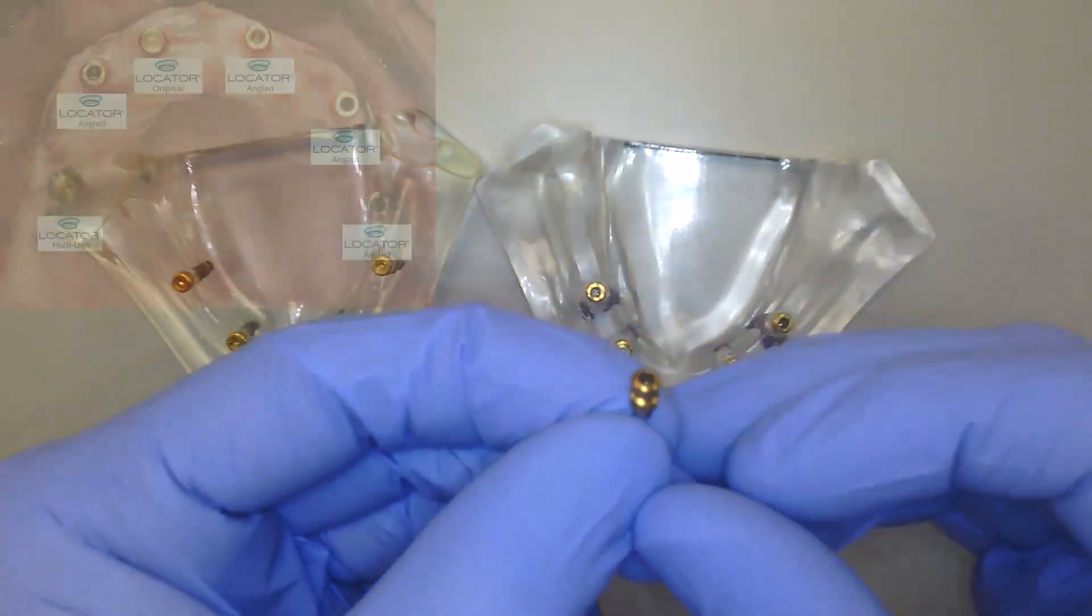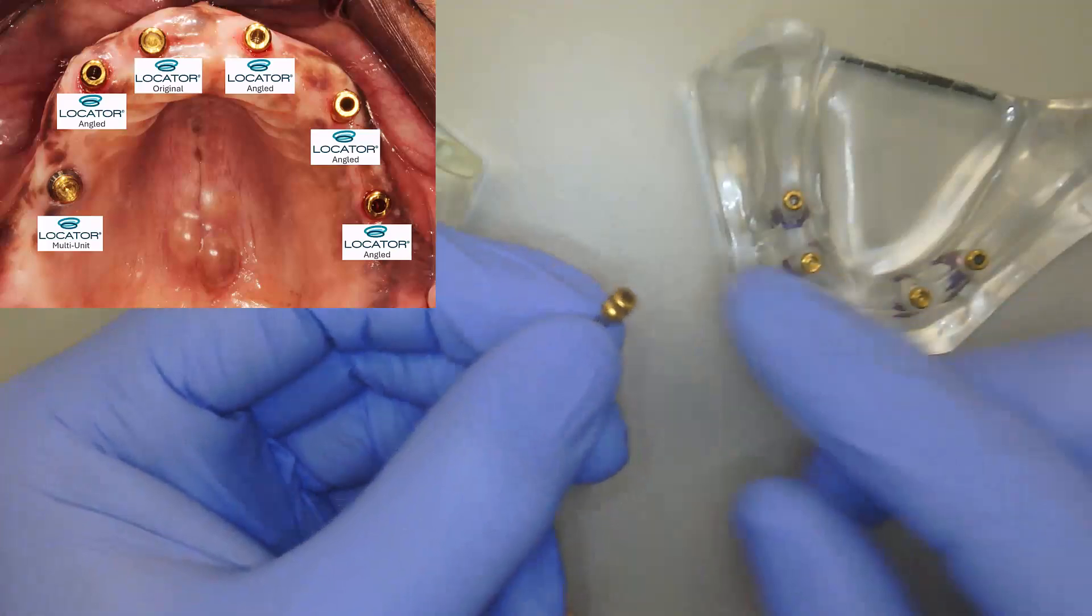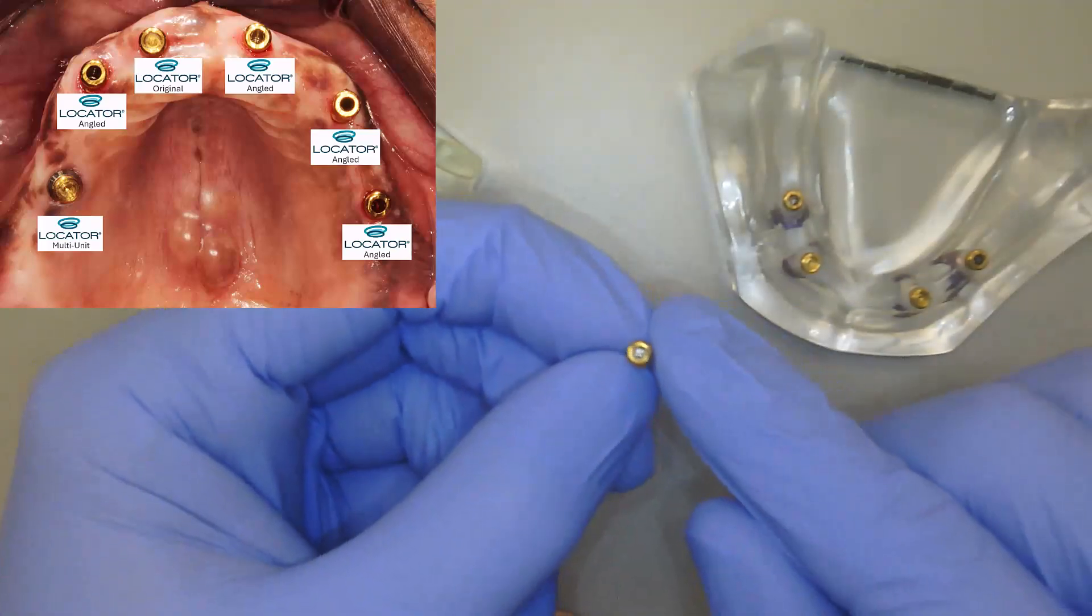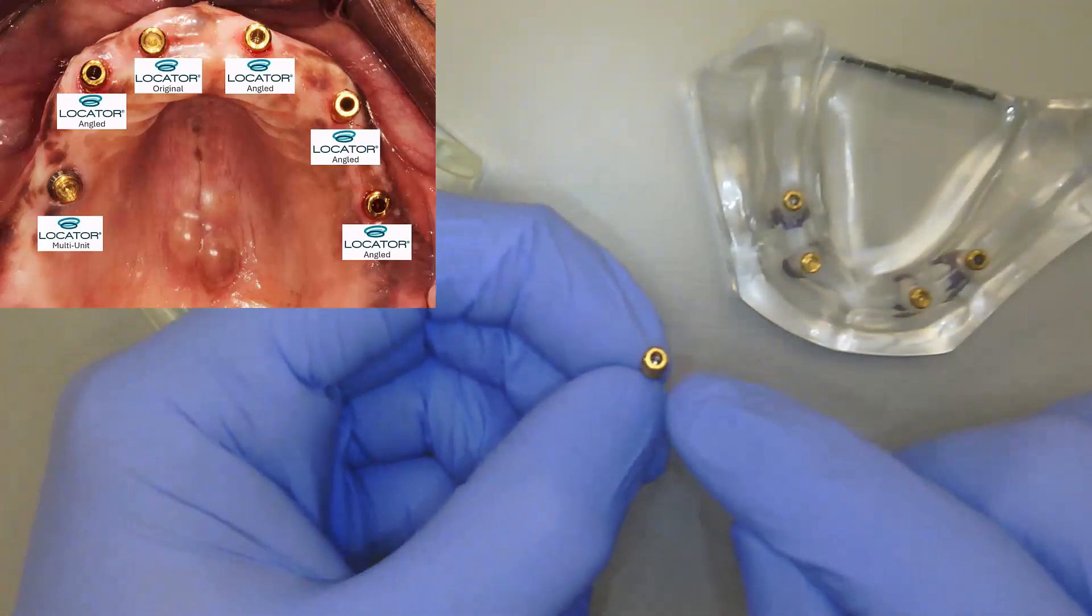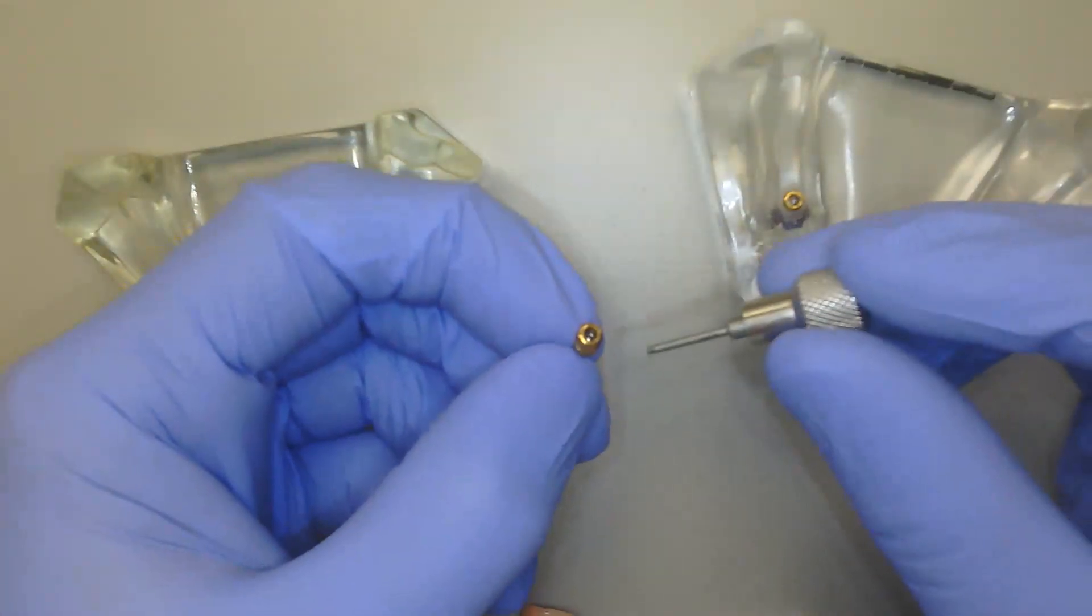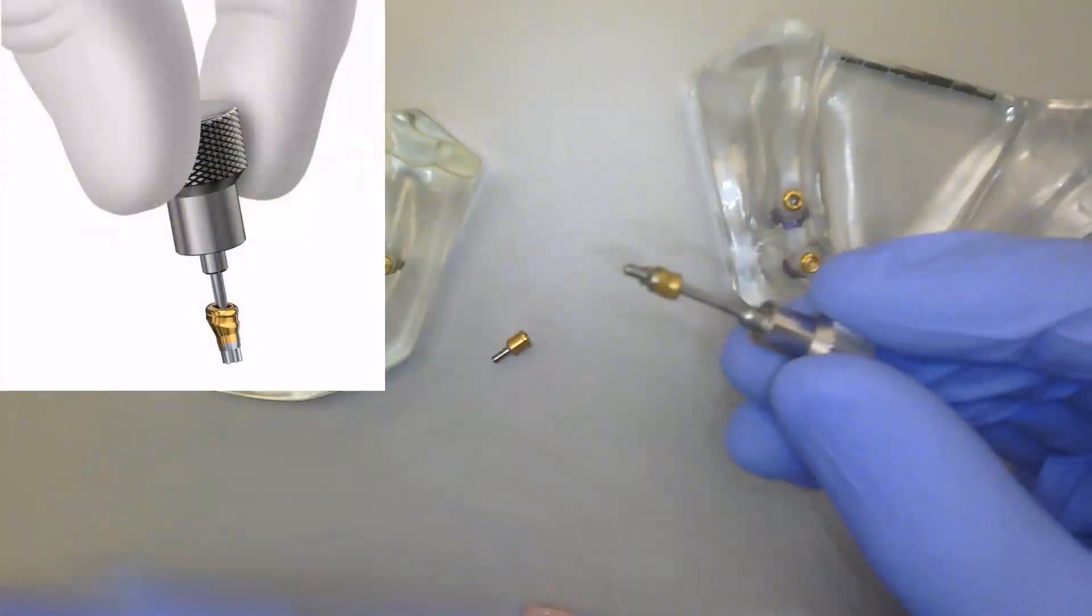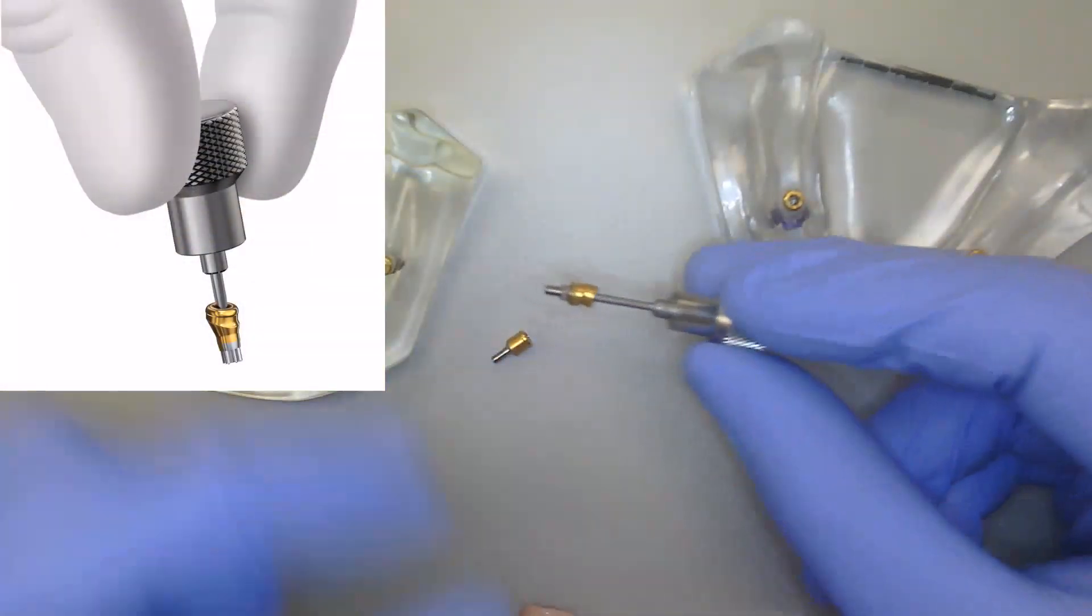And then when I put that really side by side, right here I have my locator angled abutment, which has that distinctive gold color as well as the top portion that looks just like a locator abutment. It has a little cylindrical cutout here instead of the little triangle. And that cylindrical cutout allows me to utilize an 050 hex driver to torque the abutment down.